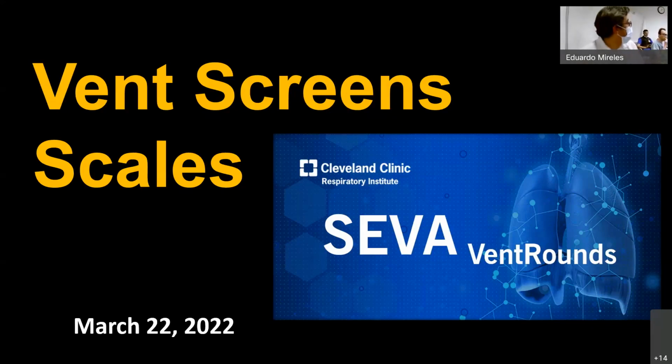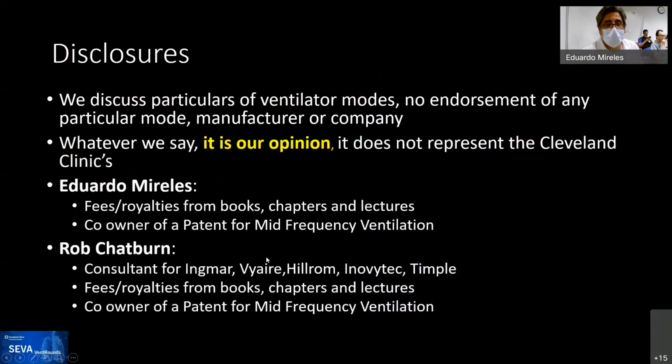We're going to do a new version of Vent Rounds in which it's hybrid. I'm sitting here with our fellows in the room, and we're just going to go through some of the screens and shots that we have done before. So, here we go. First, the disclosures.